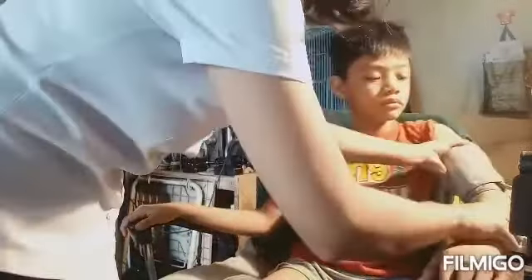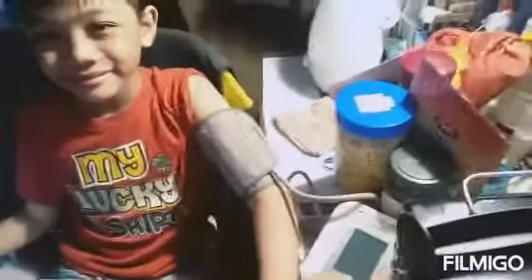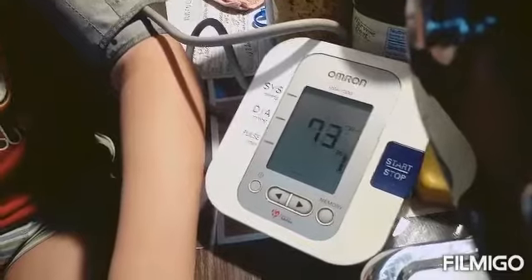Today, we will be using a digital blood pressure device. After putting the cuff into patient arms, let's wait for the result for a few minutes. We must remember that the blood pressure of a person depends on the age and sex. Nathaniel is a 10-year-old child.